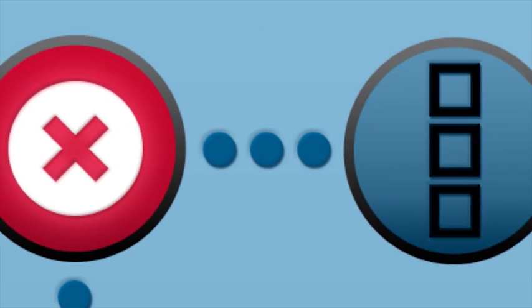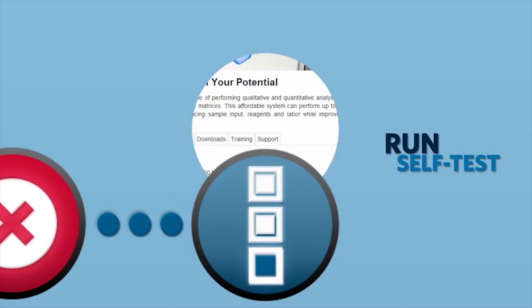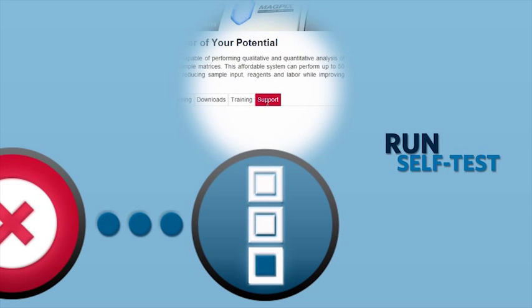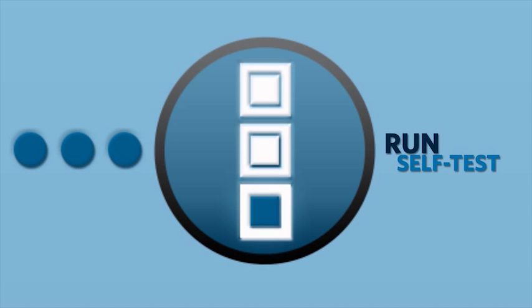The second step in the basic troubleshooting for your MagPix instrument is to run the self-test. Again, if you are not sure how to do this, refer to the corresponding video on the support tab of the MagPix instrument page. The self-test will check all hardware functions. Any problems will be detected.